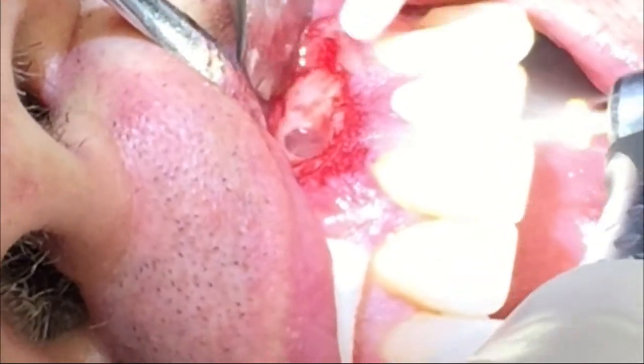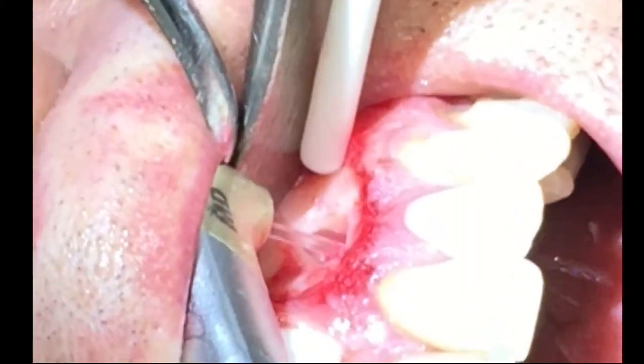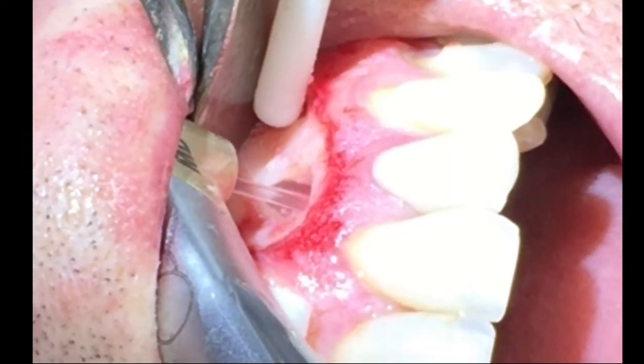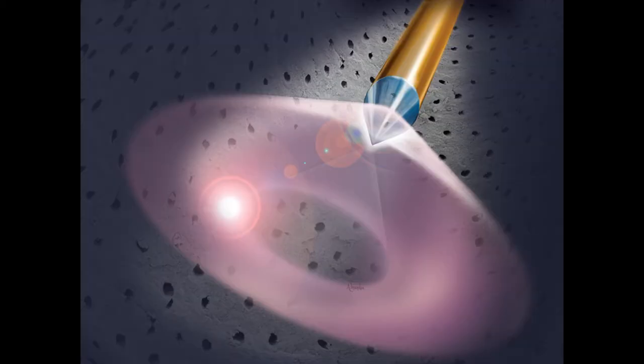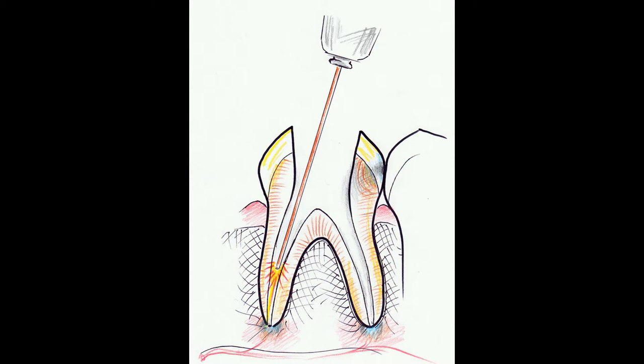We prepare our countersink trough at the root tip with a laser to apply the bioceramic seal. The walls of the void in the bone are lasered and irrigated again. Here is a quick overview of a laser root canal showing how it is instrumented. The final disinfection stages use the Waterlase side-firing tip, which goes all the way or almost all the way down to the tip of the root, creating superior disinfection.